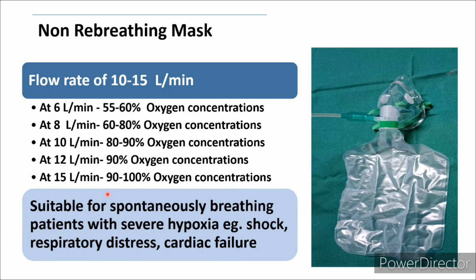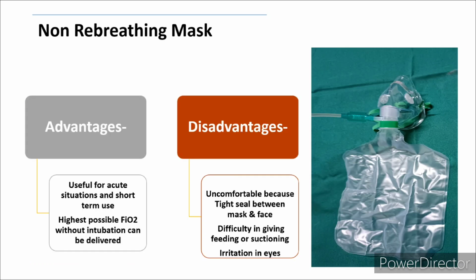It is used when the patient is having spontaneous breathing with severe hypoxia, for example in shock, respiratory distress or cardiac failure. What are the advantages? It is useful for acute situations and short-term use. The highest possible FiO2 without intubation can be delivered by the non-rebreathing mask.